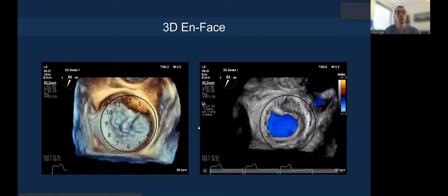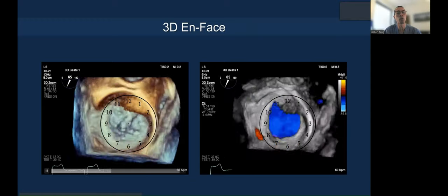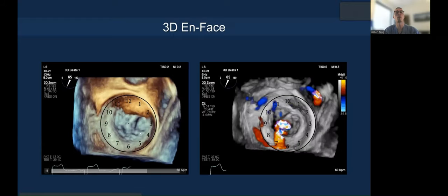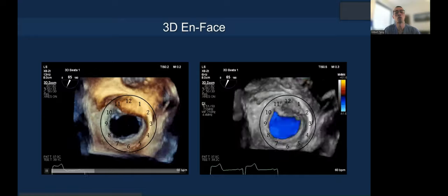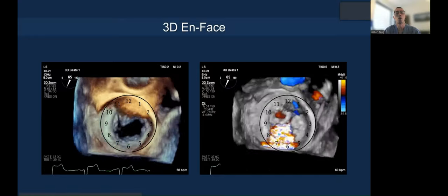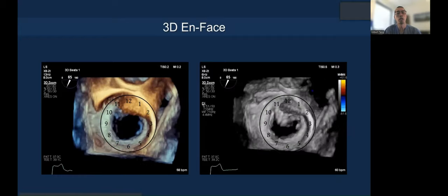On 3D en-face echo, you draw a virtual clock face and can see where the commissures are at 10 and 2 o'clock. That way you can be consistent in language exchange between the echo imager and the implanter regarding where the clip is optimally oriented. In this case, I would orient it at 12 and 6, right in the middle.